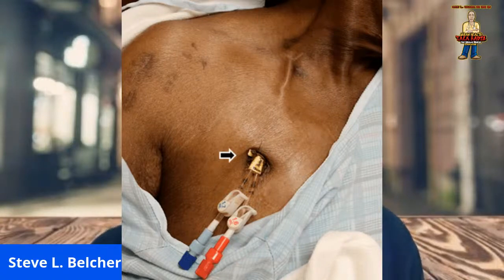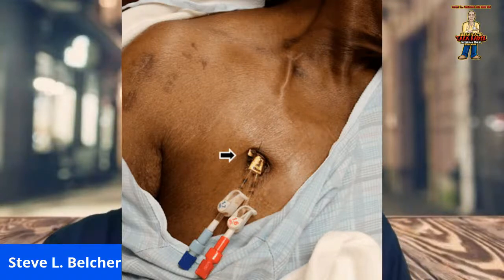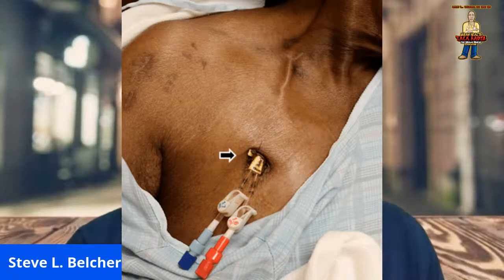Also, if the area around your catheter feels sore or looks red, call your dialysis care team at once. Again, ask your dialysis care team about signs and symptoms that require immediate attention. Also, know what your Kt/V and your URR, which is urea reduction ratio, is. All right. Know what those numbers are, because this catheter plays a big role.